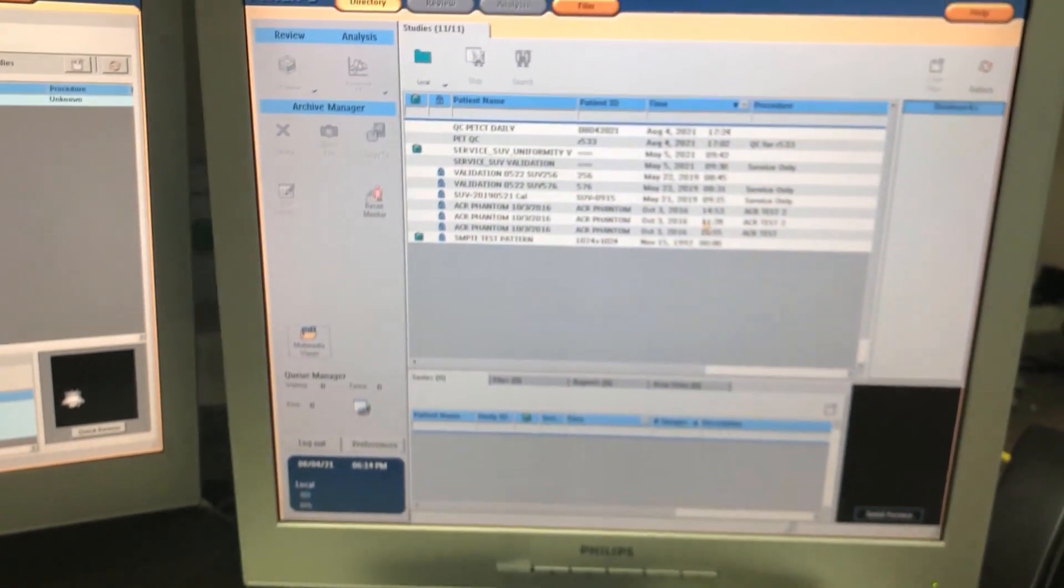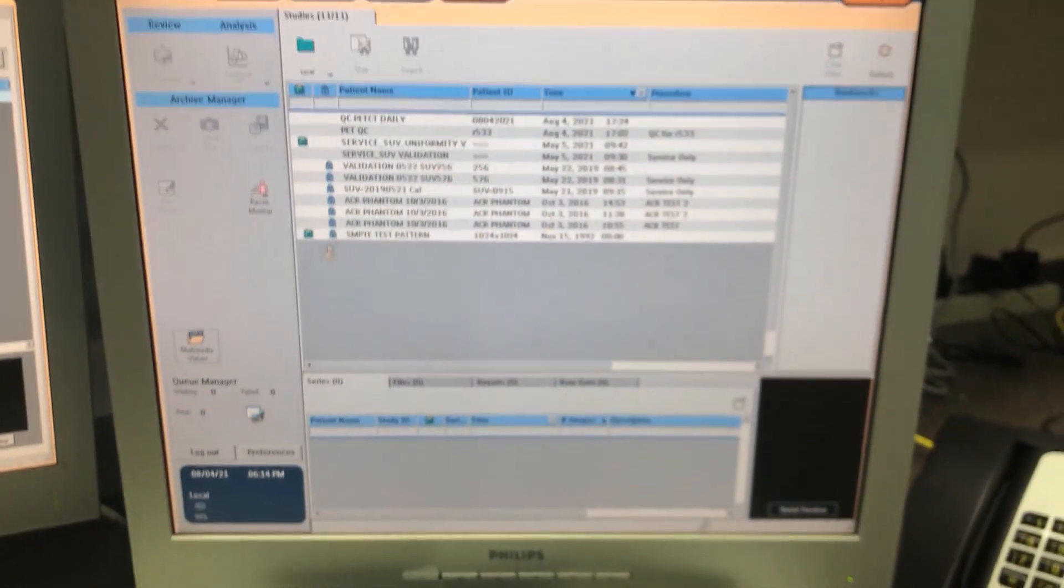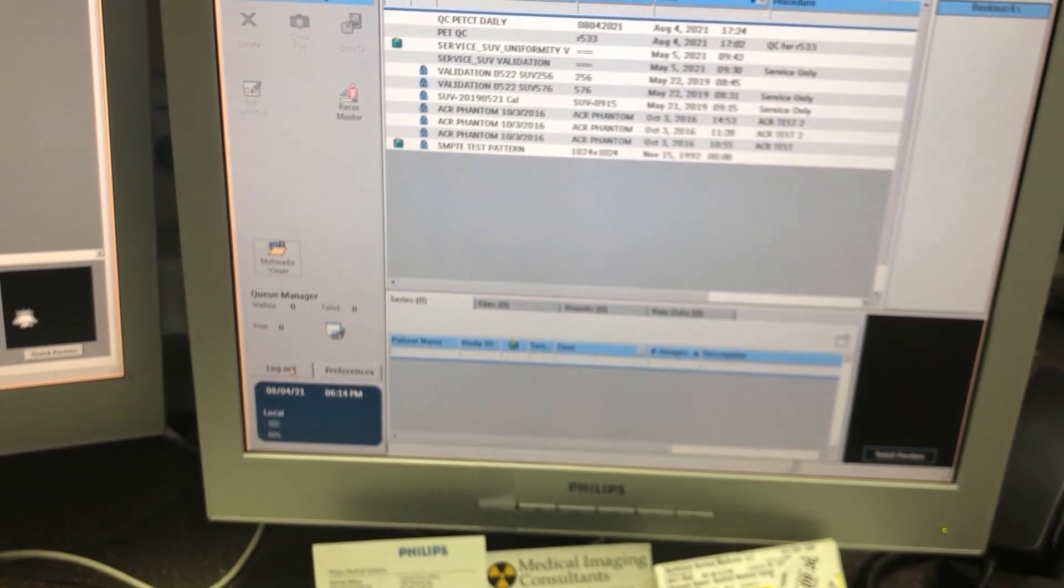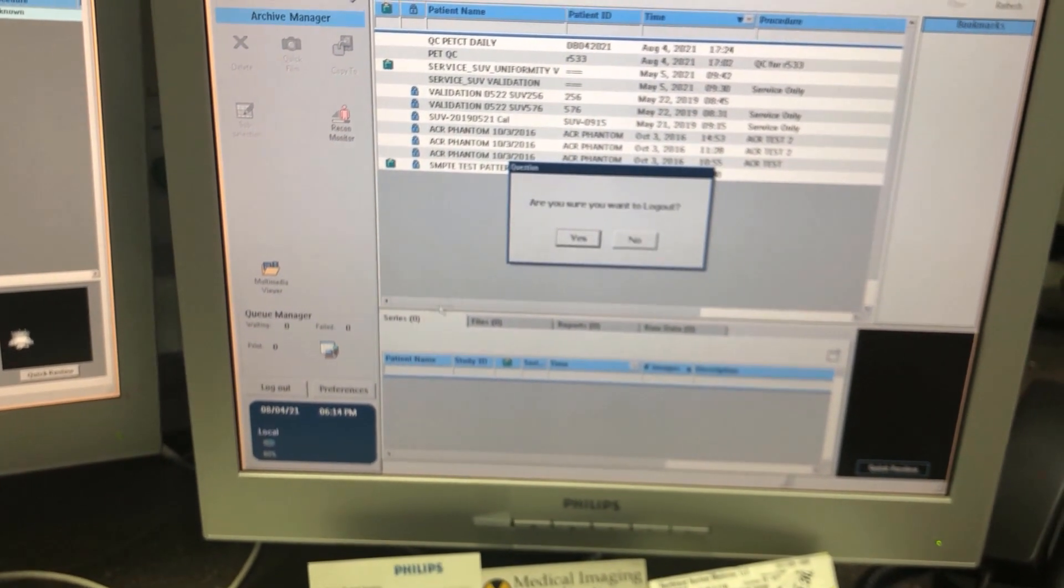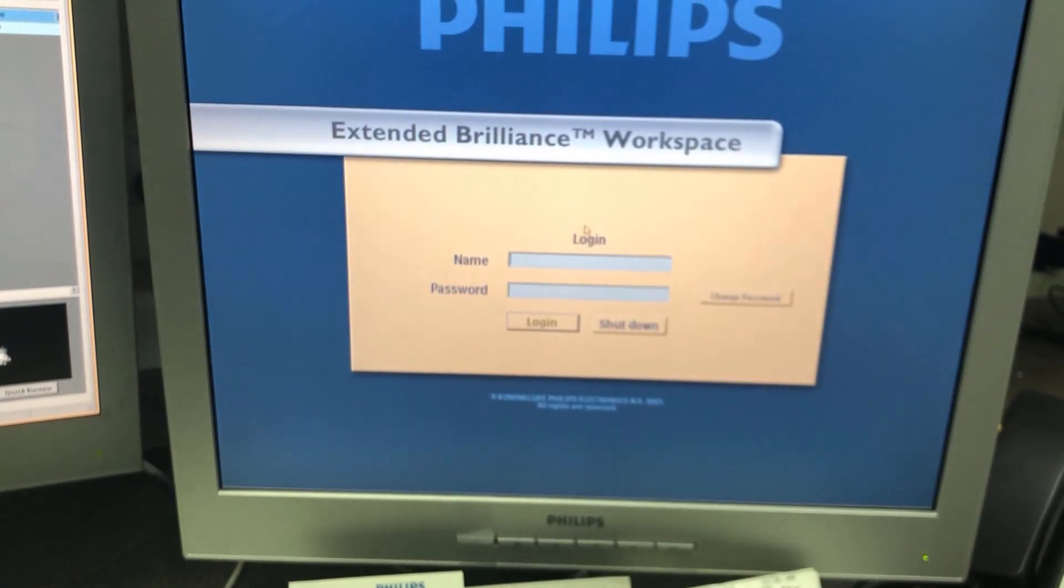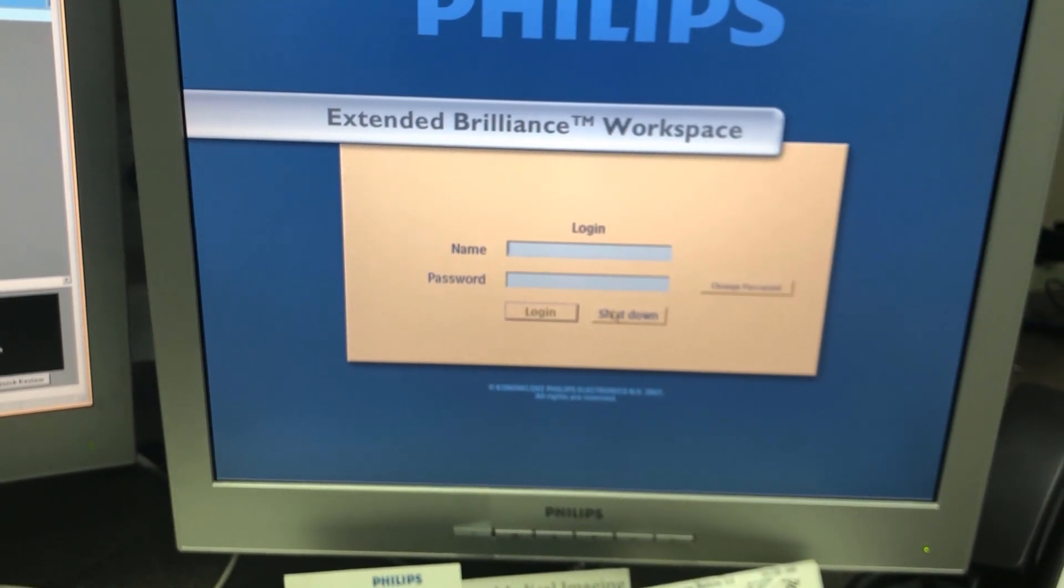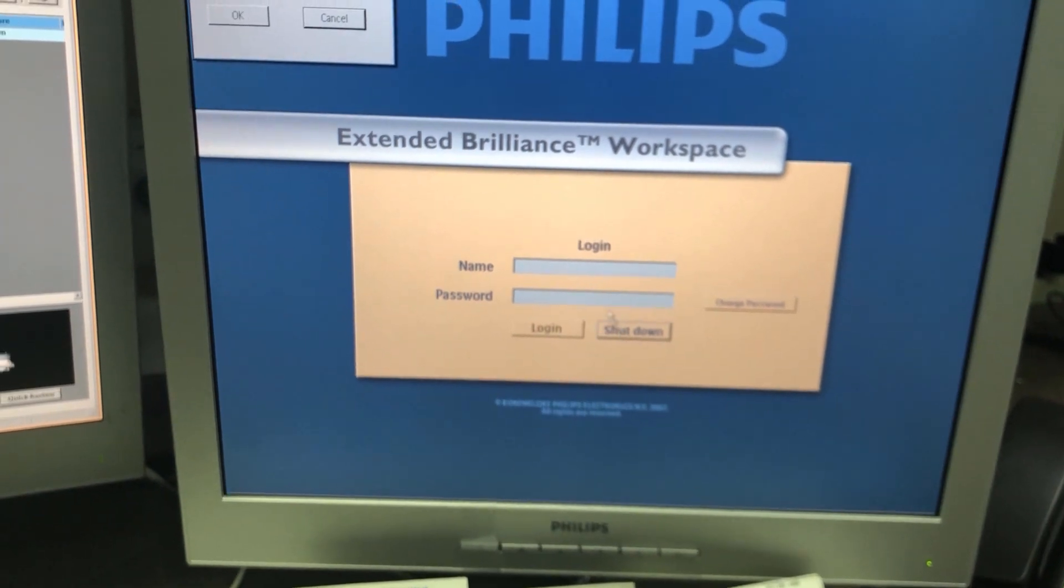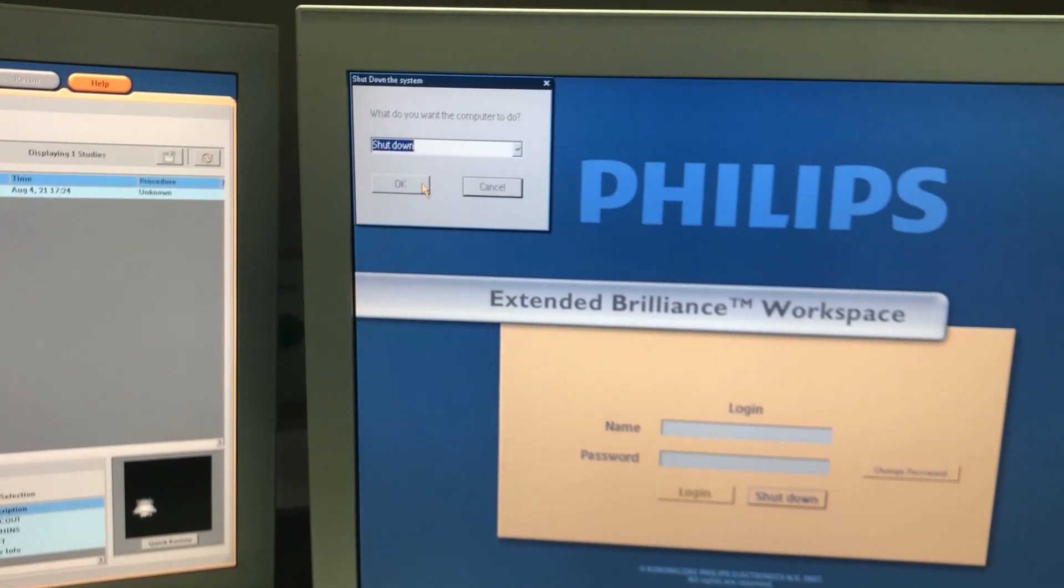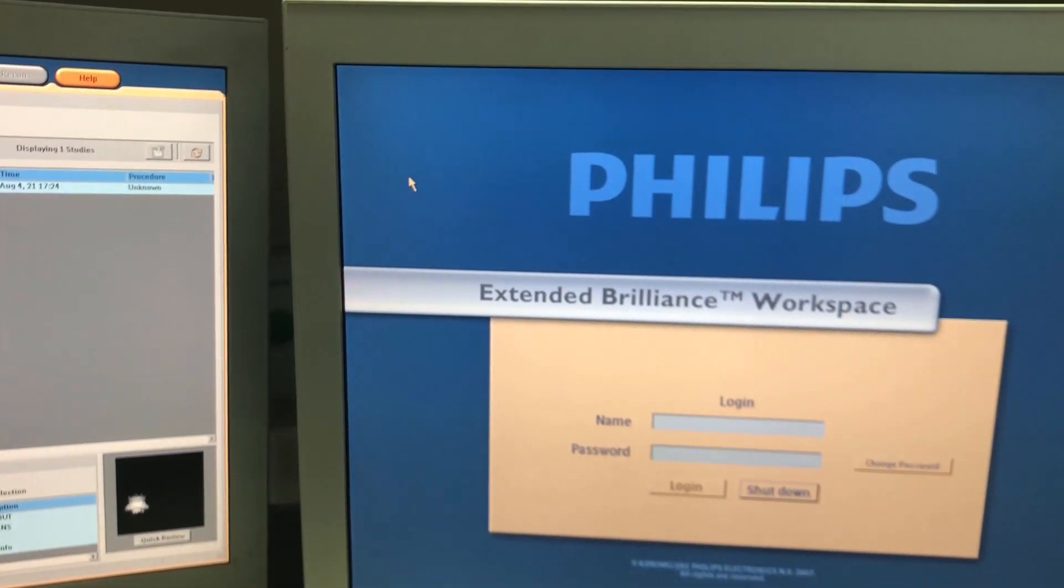We're going to come over here, this right here is the PET CT host, we're going to do log out, yes, shut down, okay.